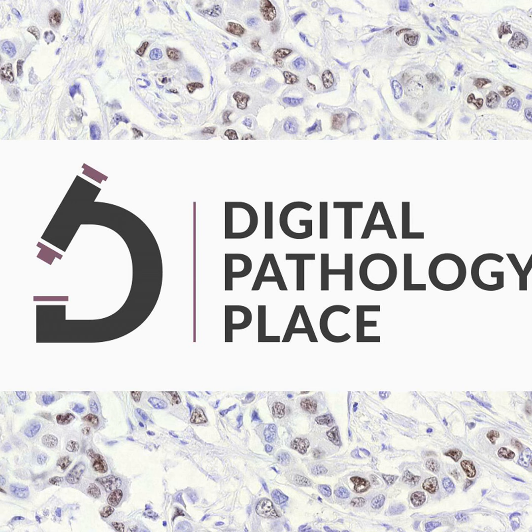So it would be like one PowerPoint slide, the next click would open up a digital slide, the next click could open up a radiology slide. Otherwise it is very cumbersome when people are trying to add digital slides to their presentation. They would first build a PowerPoint, and then when they're presenting, they would click the button where the PowerPoint would then come down and the digital slide will open up. So within this system now, it is just one seamless click, one after the other.